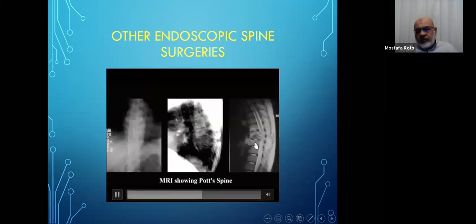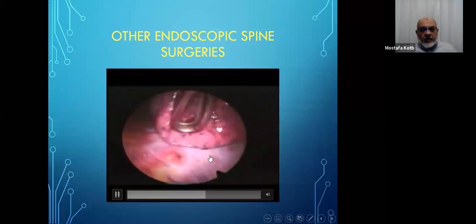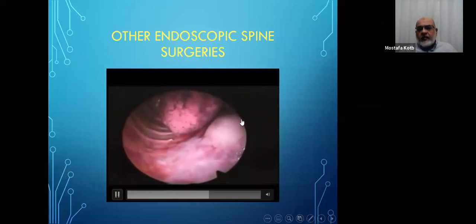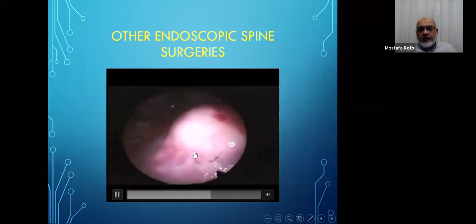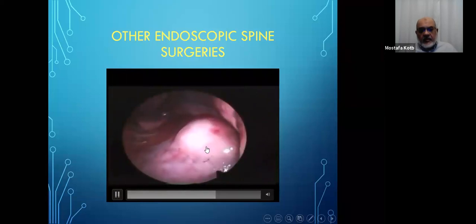In cases of Pott's disease, it's also a very good indication for endoscopic surgery. Thoracoscopically, you go in and expose the cold abscess with the endoscope, and you start by opening up the abscess and draining the pus.